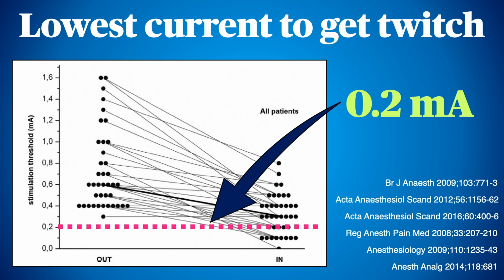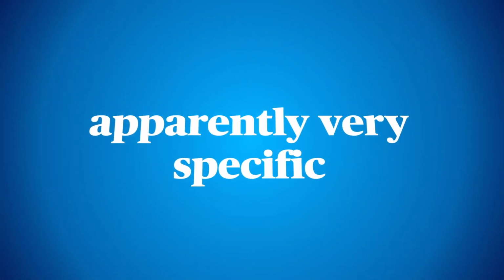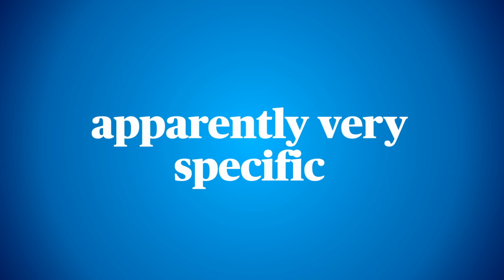We don't use nerve stimulation to find nerves, we have ultrasound for that, but this is a way to help stay out of nerves. And so nerve stimulation is insensitive, but is apparently very specific. If you're getting a twitch at a very low current intensity, you're either kissing that nerve or you're inside it.